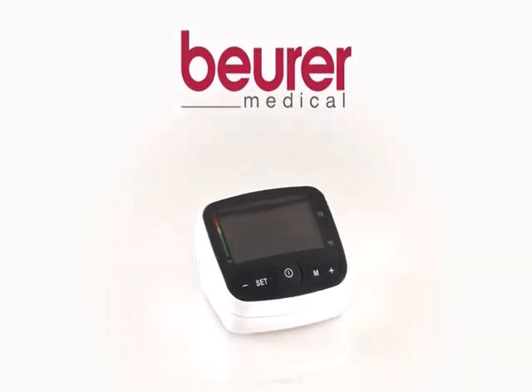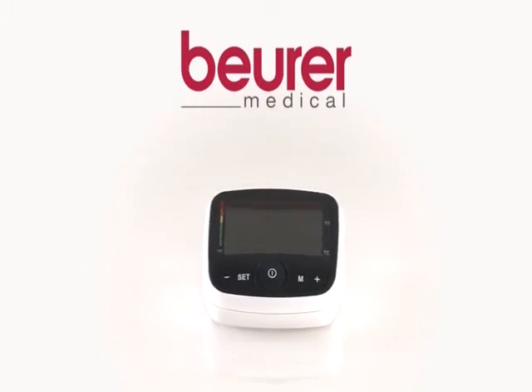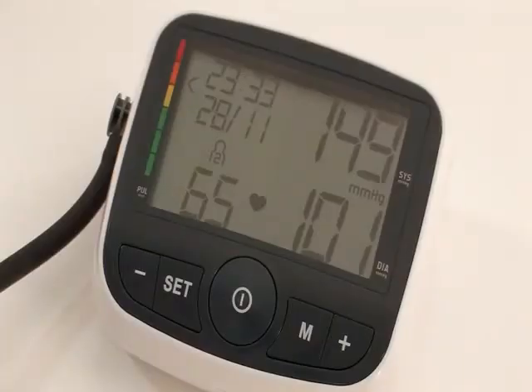Measure blood pressure both safely and simply. The fully automatic blood pressure monitor BM40, in a compact design, shows blood pressure values and pulse rate on its XL display at a glance.